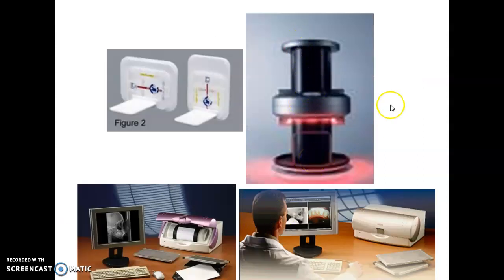This is the digitizer. If you have phosphor plates, and they're very similar to film sizes, they are reusable, and they're placed into sealed little packets. Those packets are what the phosphor plates are placed in the mouth. They're exposed, and then you would remove them from those packets. Those would be disposed of, and the phosphor plates are placed in the top of this digitizer, and they slide through little slots and end up in this tray down at the bottom.